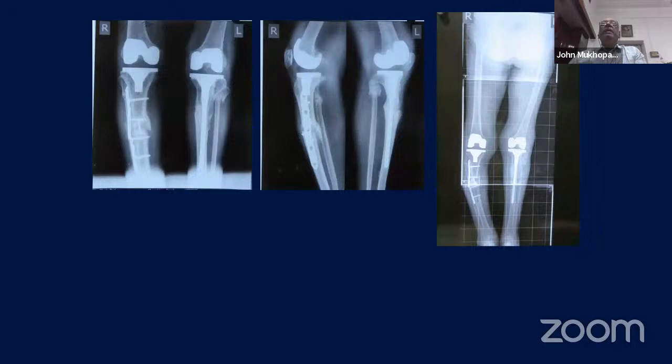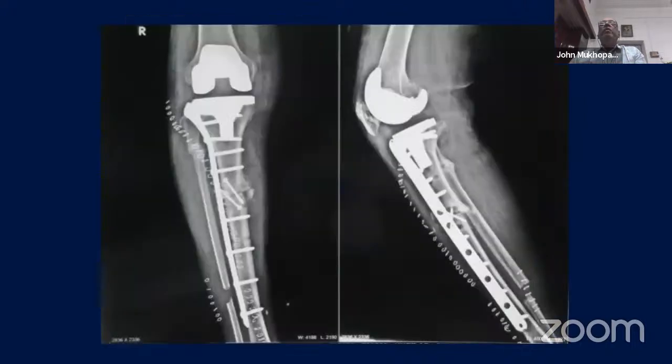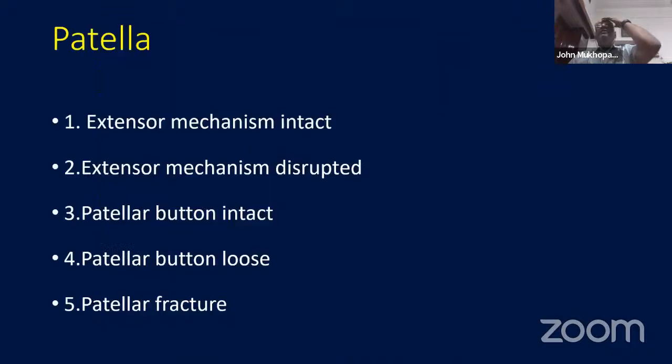She broke at the plate and at the fracture level, and the plate broke. And this is how she came to us. And here we had to then put a revision fixation of the plate. We also did a fibula osteotomy, and this fracture then went on to heal.